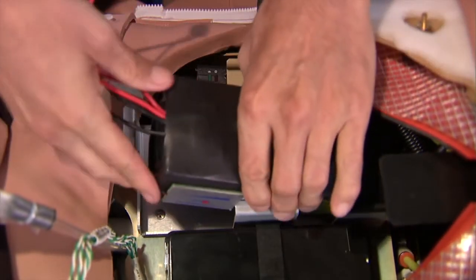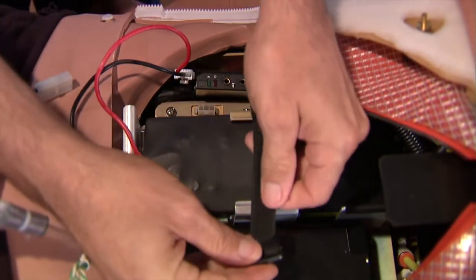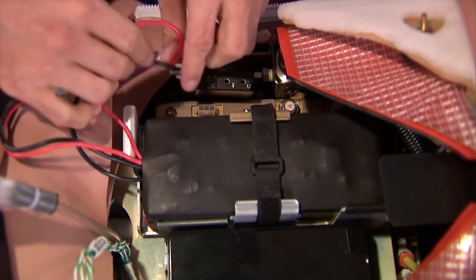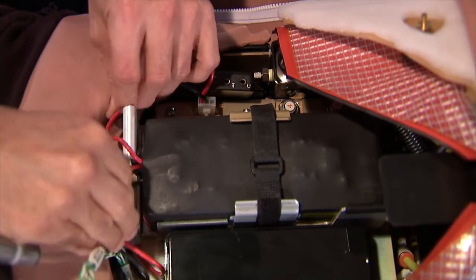Slide the new battery into place, with the leads pointing toward the feet of the simulator. Fasten the Velcro strap to hold the battery in place. Plug the male connector into the simulator. Tuck the battery leads into the abdominal cavity so they're out of the way.